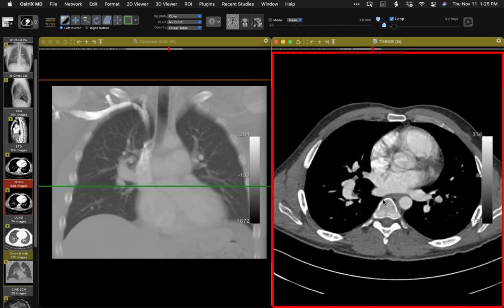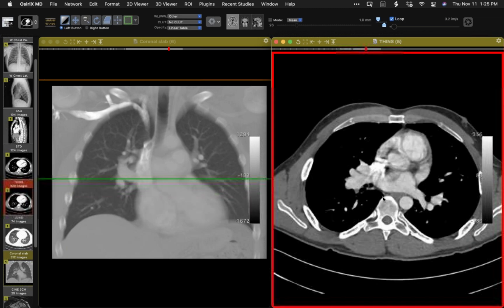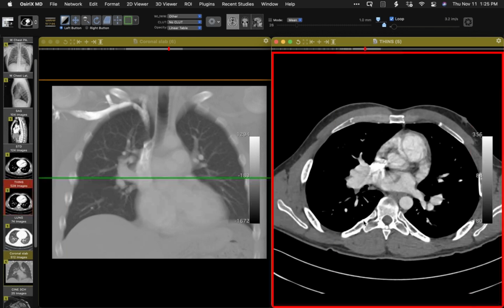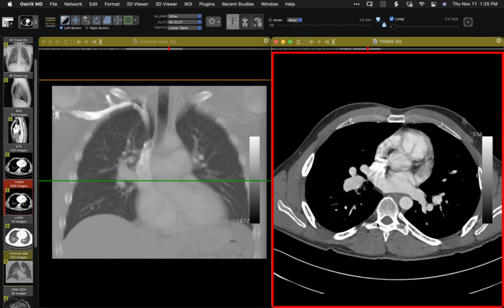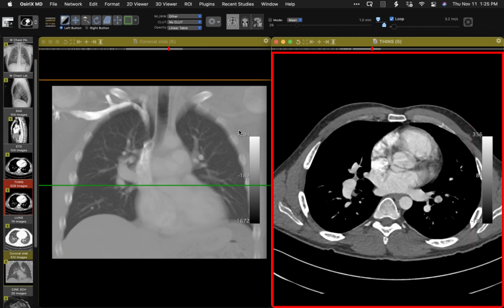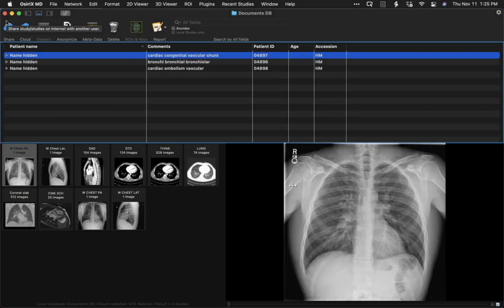Yeah, and that's always important, because I think we've all seen cases of this missed on transthoracic echo, just because it's the furthest away from their probe. If they're doing a 4-chamber view from the outside, that's hard for them to see on echo. Good. It's a very nice demonstration of so-called balanced distribution of pulmonary blood flow, left to right shunt, and the patient's going to cardiology.